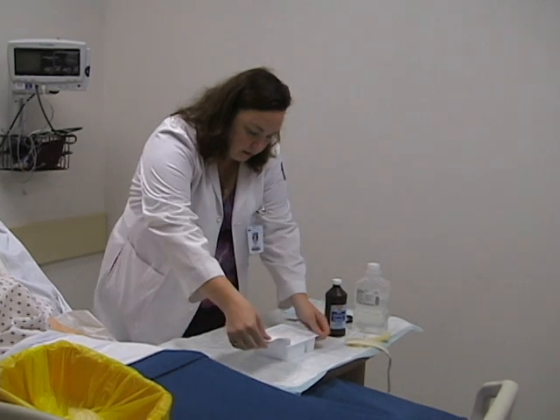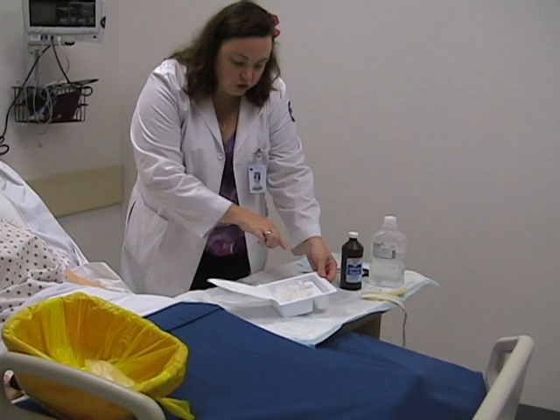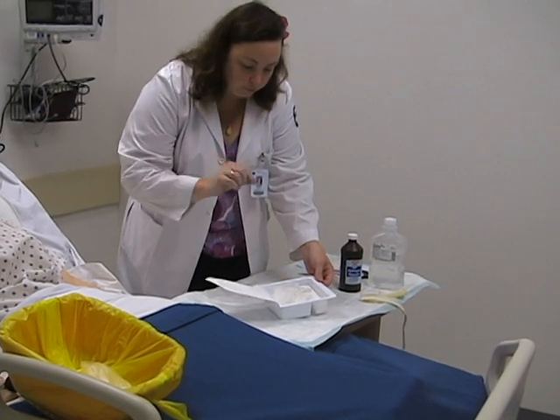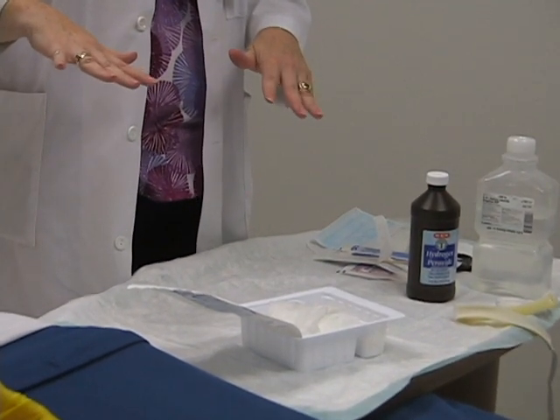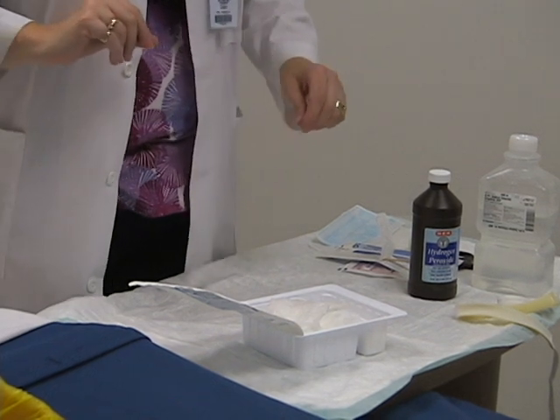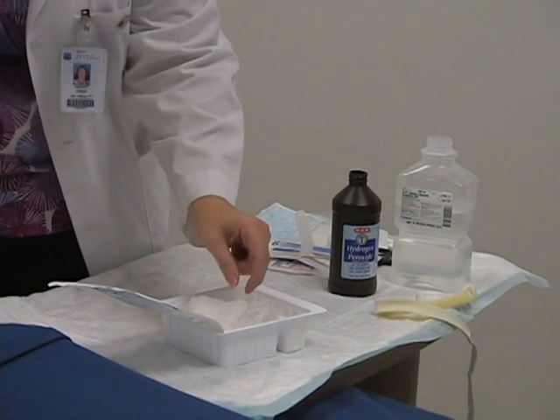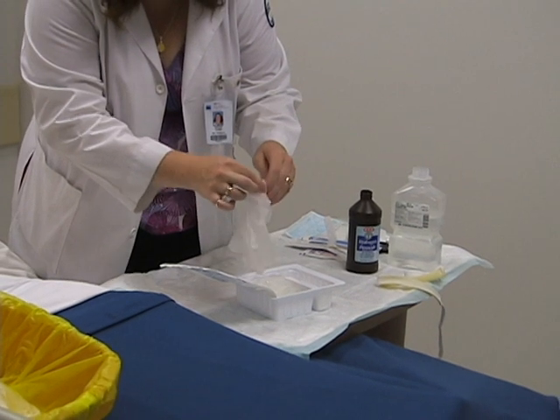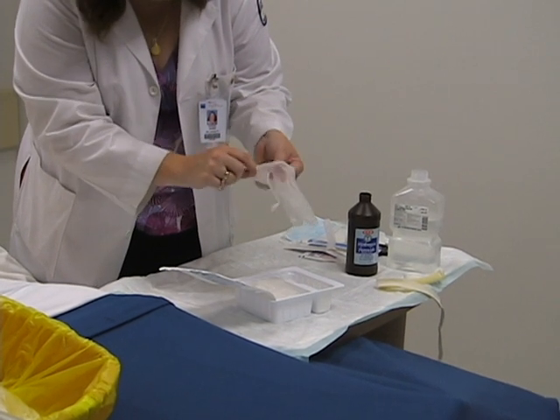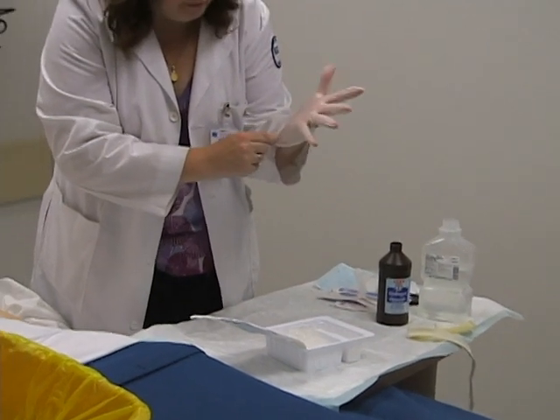I'm going to open up the tray. There are two basins in here — one's built into the tray, the other is removable. We have a sterile drape and a pair of sterile gloves. First thing I'm going to do is take my tops off and put my sterile glove on. Make sure you touch the inside of the cuff and put it on your dominant hand. This is your sterile hand and this is your clean hand.